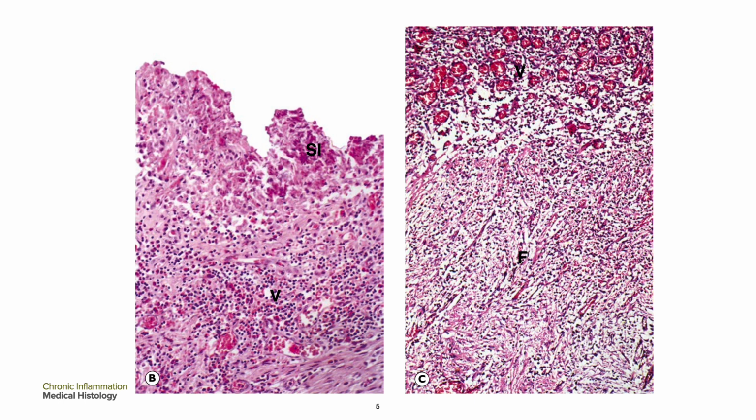In this deep ulcer, the muscular wall, M, is completely replaced by the ulcer crater, the granulation tissue, and the scar. If a large blood vessel is present in the ulcer base, erosion into the vessel leads to bleeding into the stomach, giving rise to hematemesis, or vomiting blood, or melena, black tar-like feces composed of altered blood.